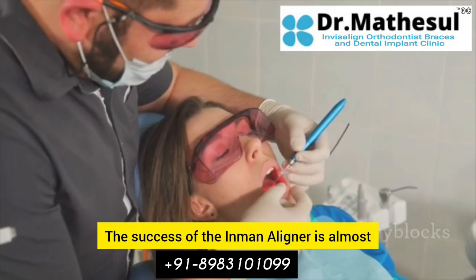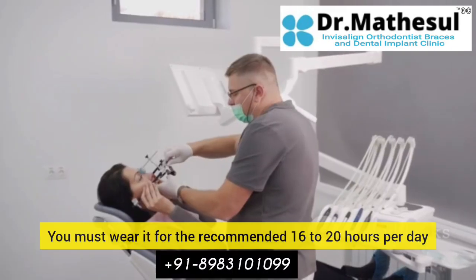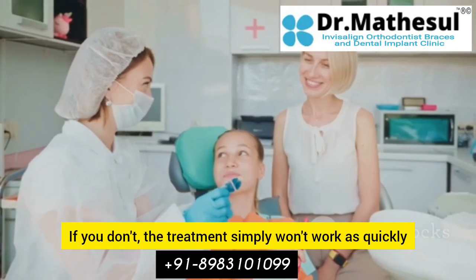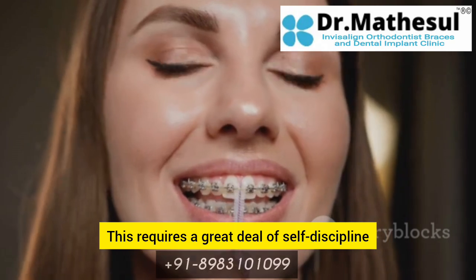The success of the Inman Aligner is almost entirely dependent on your compliance. You must wear it for the recommended 16 to 20 hours per day, every single day. If you don't, the treatment simply won't work as quickly or effectively as it should. This requires a great deal of self-discipline.